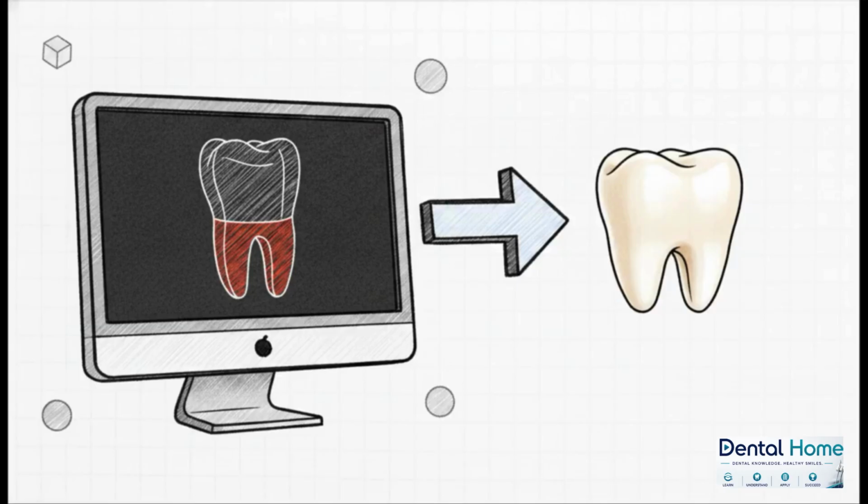The software can design the most gorgeous tooth imaginable, but if the underlying path of insertion wasn't planned correctly by the clinician in the first place, the software is just going to highlight the undercuts and collisions. Digital precision is amazing, right? But it must perfectly translate into physical reality. The software is entirely dependent on the foundational planning of this one single physical path.